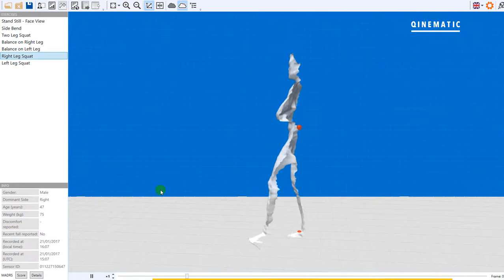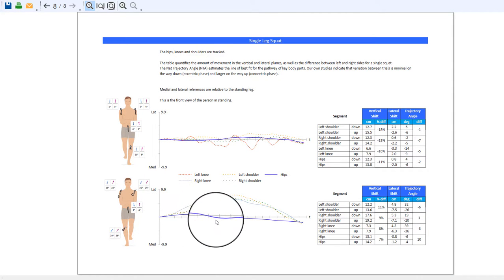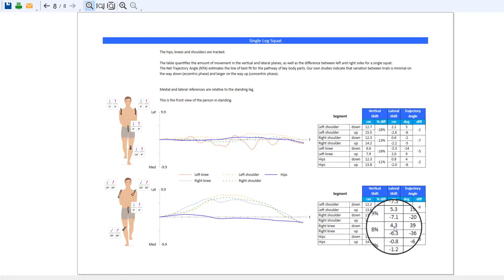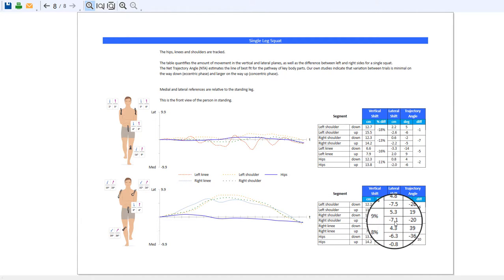From the side it looks like a fairly normal squat, but from the front it's very clear what's going on. The biomechanics report shows not so much movement of the pelvis, and the start position is not the same as the end position. There is considerable lateral movement of the right knee, a little bit of shakiness, and then a return to the top of the squat. The shoulders are moving considerably to compensate for that knee action. Looking at the displacement of the actual knee: 4 to 5 centimeters laterally from start to end position, at an angle of 39 degrees, with the shoulders moving approximately 7 centimeters.